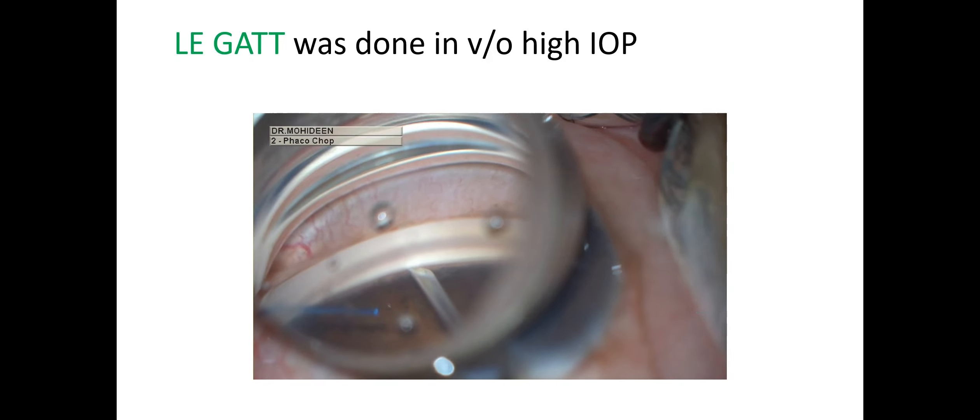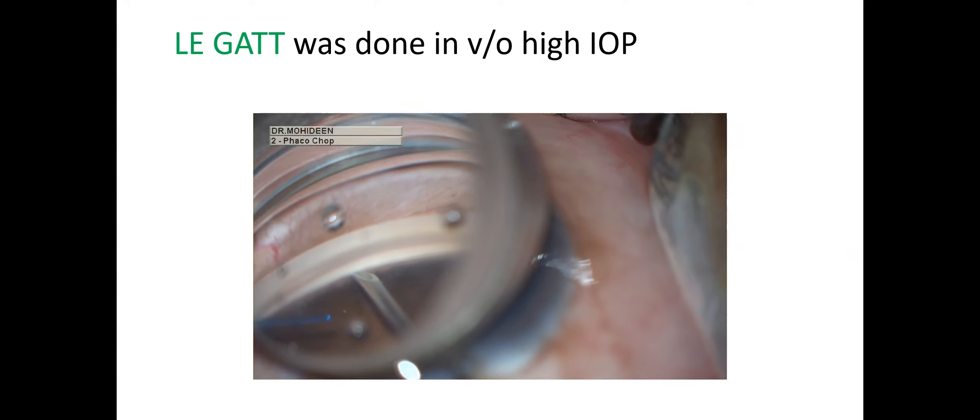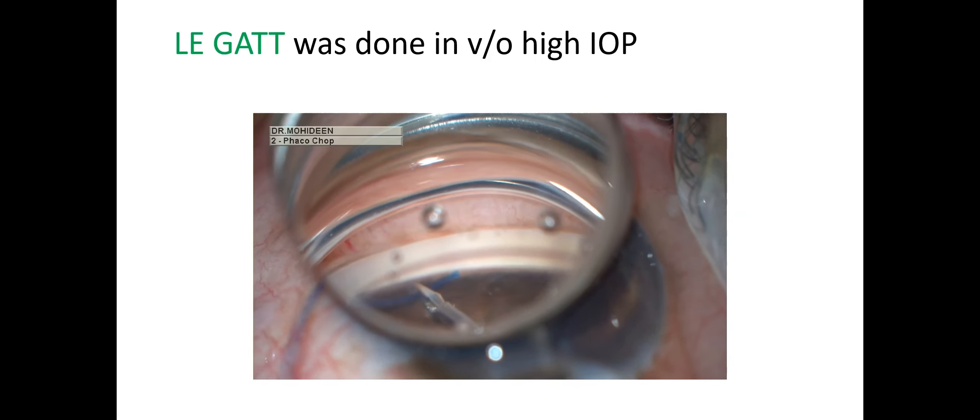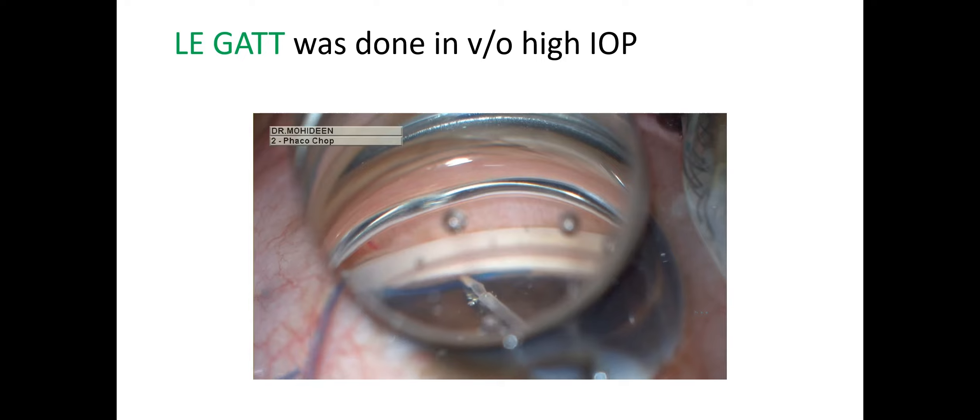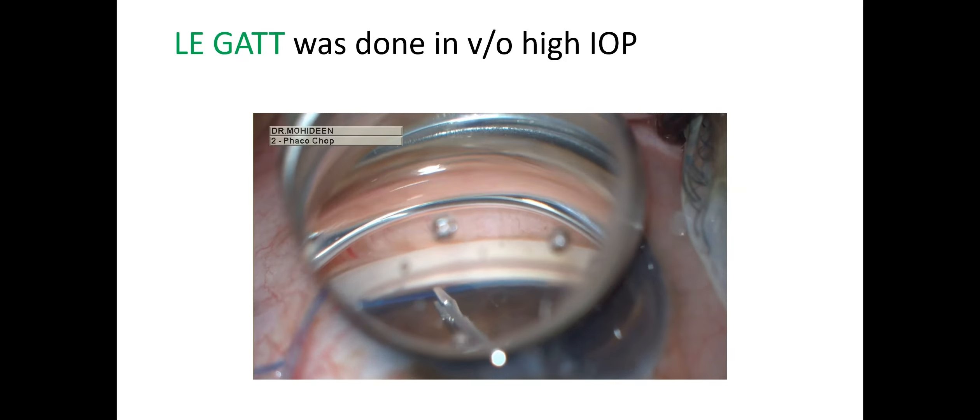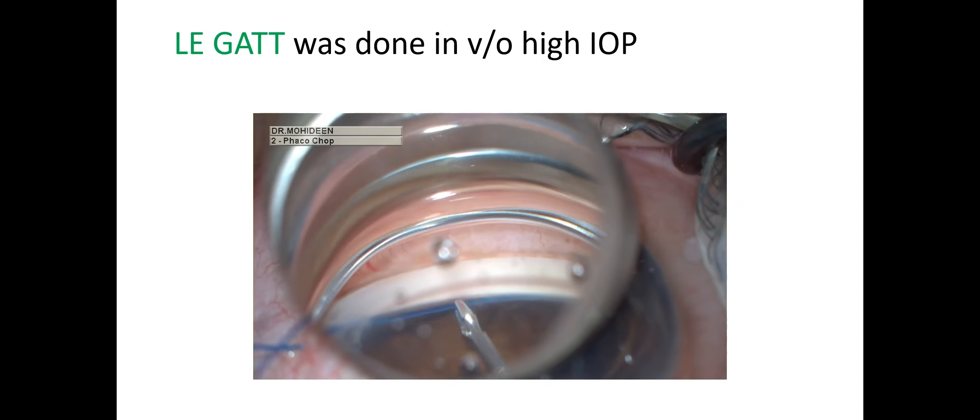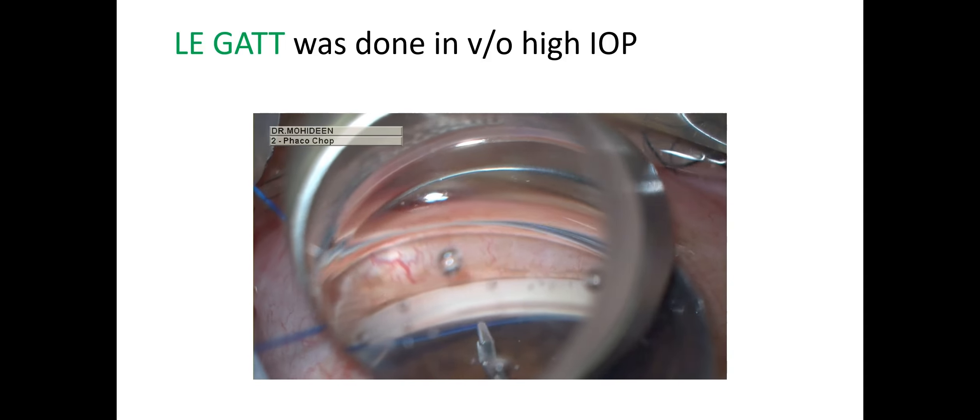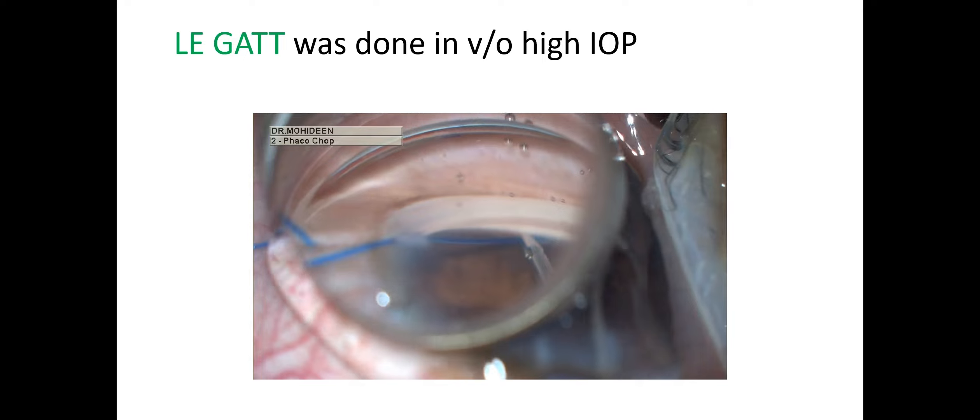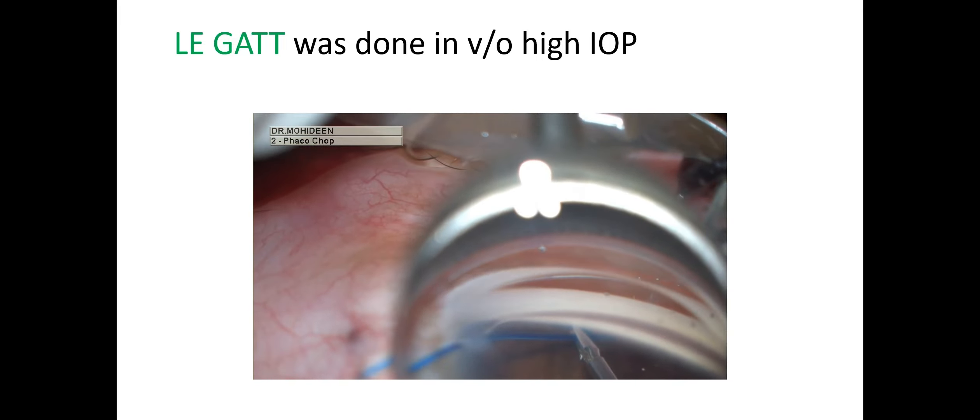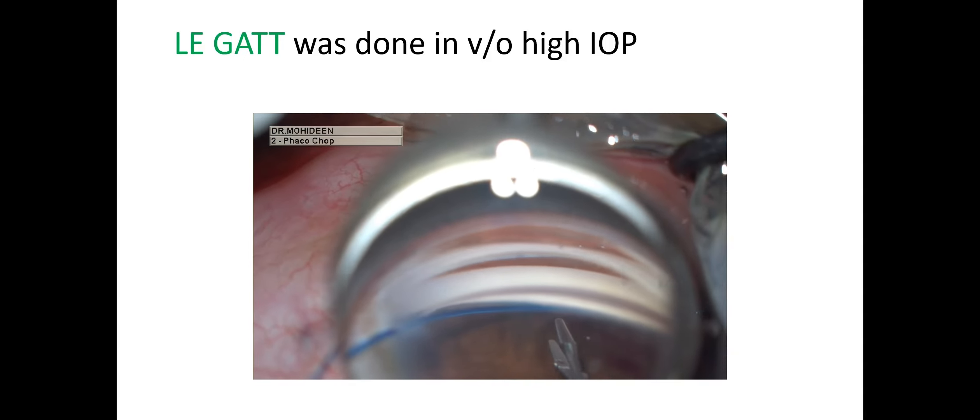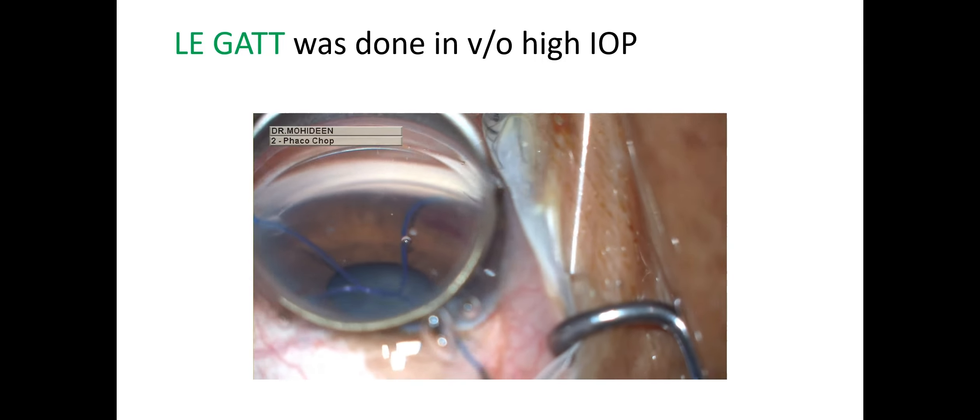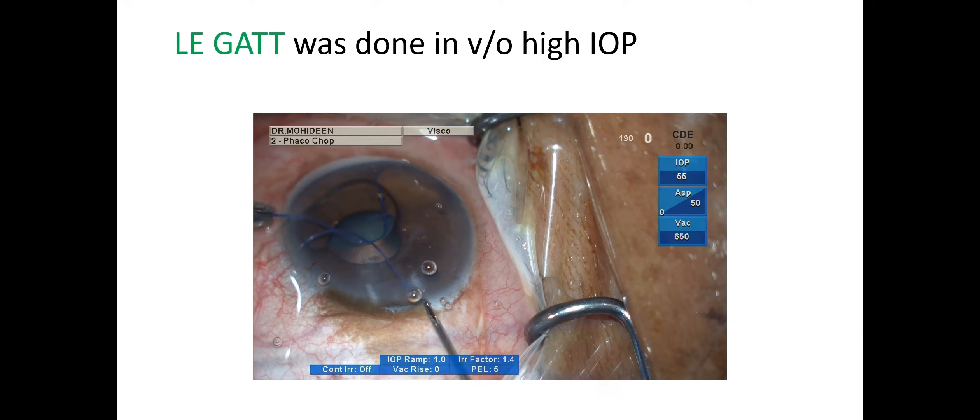After putting adequate viscoelastic and docking the goniolens, a goniotomy was made and Schlemm's canal was exposed. Then the blunted prolene tip is introduced into Schlemm's canal and threaded slowly along the canal 360 degrees. In small strokes, the prolene suture is pushed gently. When the tip appears on the other side, it is gently grabbed using Max-Grip forceps and the 360-degree GATT is completed.